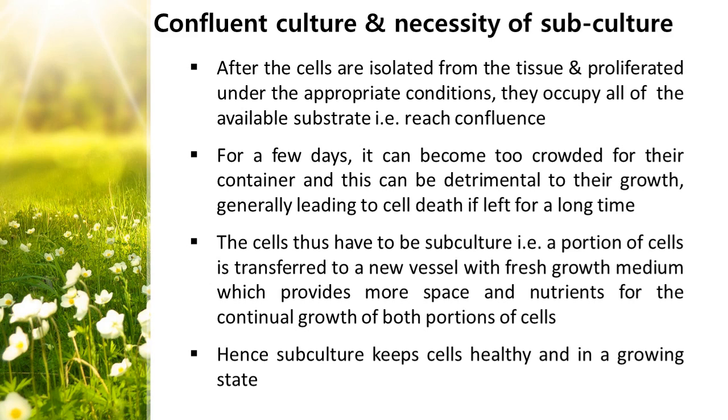The concentration is also mentioned, 10 to the power of minus 4 to 10 to the power of minus 5 molality. It includes major vitamins like folic acid, nicotinamide, pantothenate, choline, pyridoxal and thiamine. Apart from that, it also includes inositol and riboflavin.